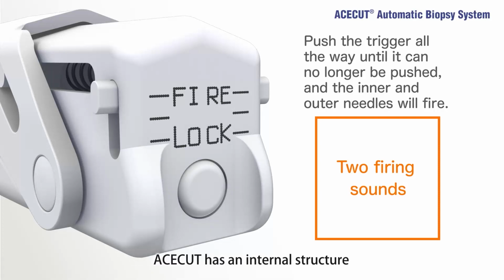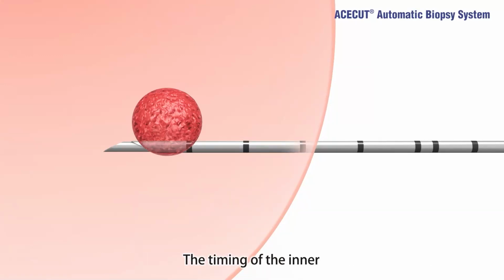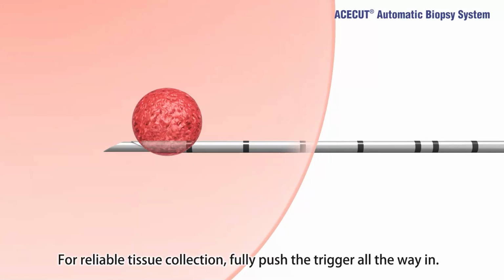ACECUT has an internal structure that fires the inner and outer needles in a 2-stage operation. The timing of the inner and outer needle firing varies with how the trigger is pushed. For reliable tissue collection, fully push the trigger all the way in.